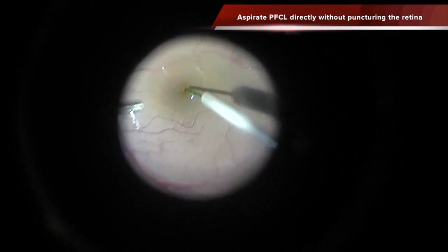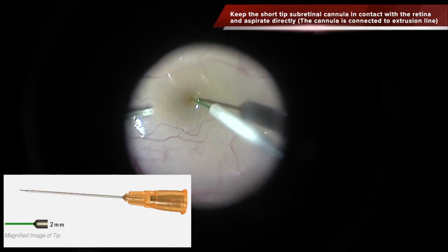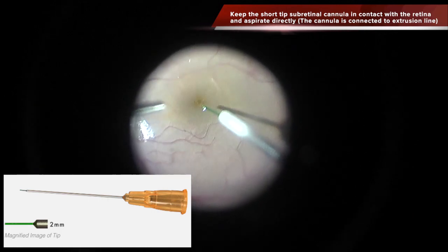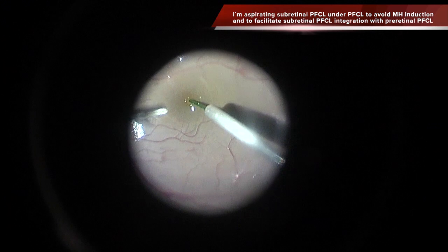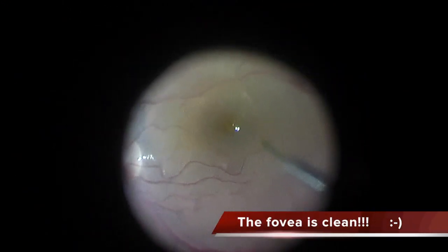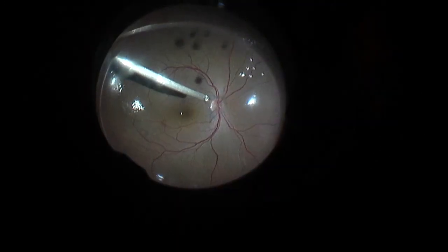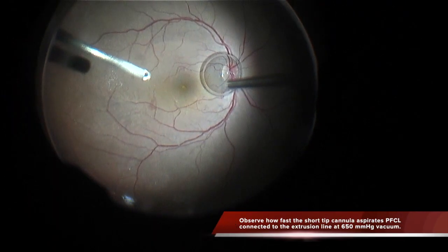First you get in contact with the retina and directly aspirate using the suction of your vitrectomy system. By capillarity, the perfluorocarbon bubbles are removed from the subretinal space. Doing this aspiration under PFCL has the advantages of avoiding a macular hole when aspirating the foveal area, and also it helps the subretinal PFCL removal because once the subretinal bubble is in contact with the large preretinal bubble, it is transferred into the big bubble as well.